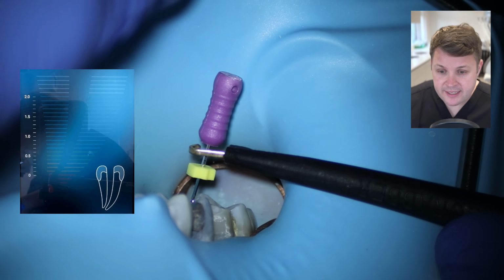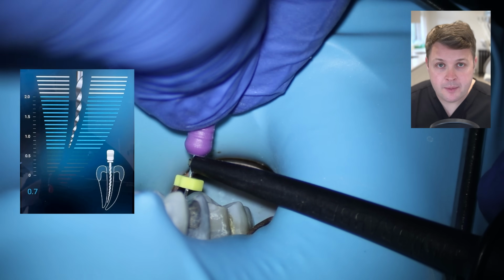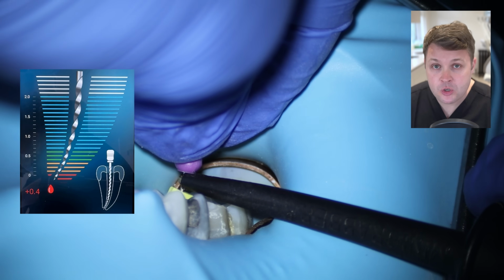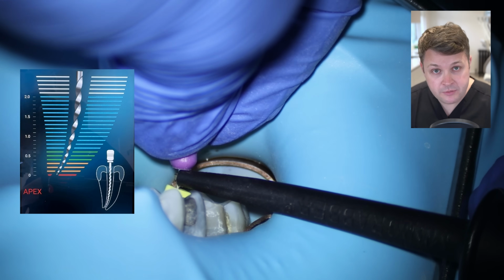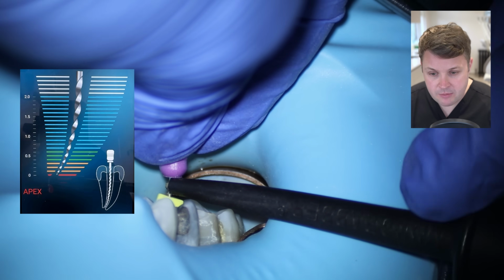We're now going to get the working length in the palatal. Again, this hand file drops right down to length. It pushes all the way to 0 really easily. Again, it's the same protocol with the working length as with the DB: we're going to push the hand file through the apex, not too far, of course, you don't want to damage the periapical tissues, and then as we back it up, that's our 0 reading.